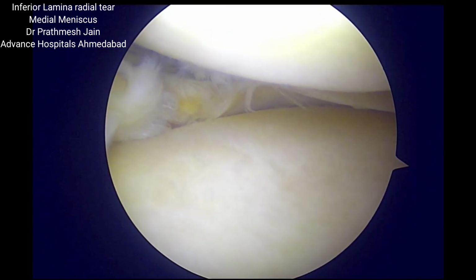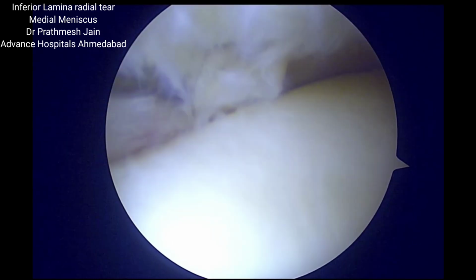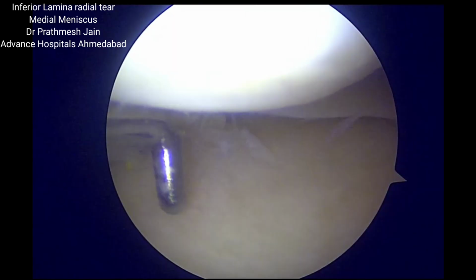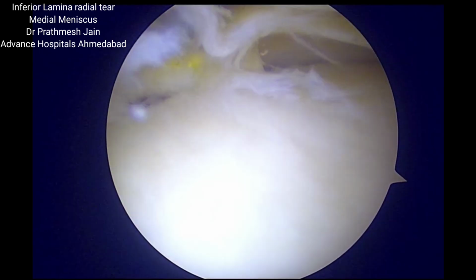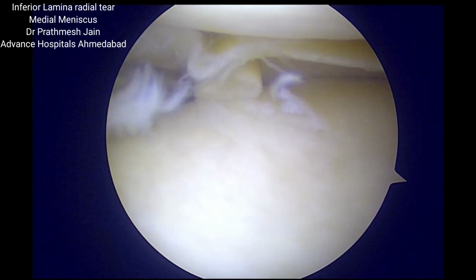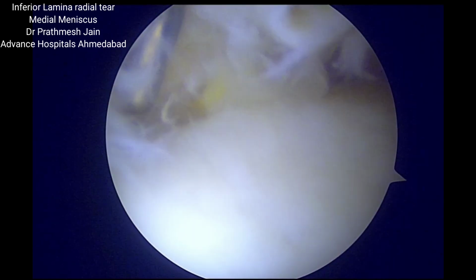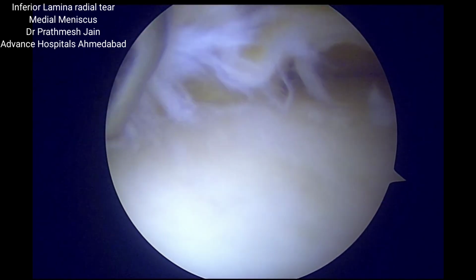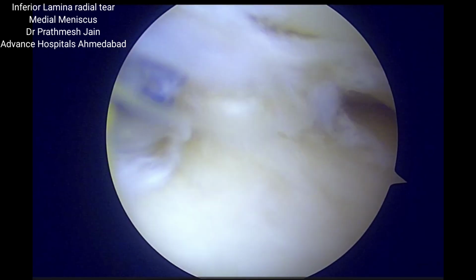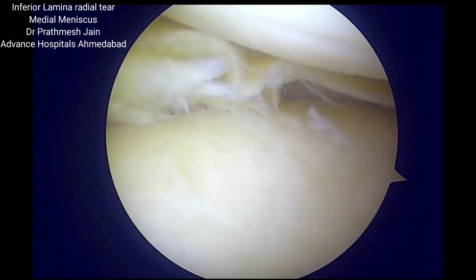So it is very important to identify the exact pattern of the injury and to identify whether the patient is having an undersurface radial tear, because a radial tear of even a single flap of the meniscus is equivalent to a meniscectomy. So here we have identified the inferior tear, we are just preparing it, and then it is good to repair it in a fashion so that the sideways repair is possible. So we want to do a sideways repair of the meniscus.